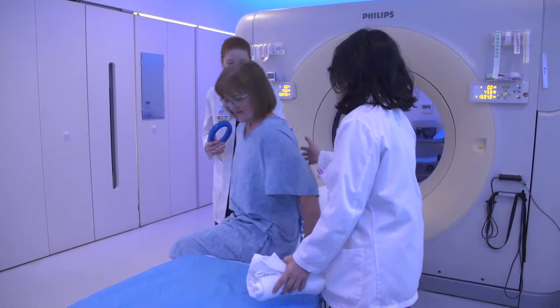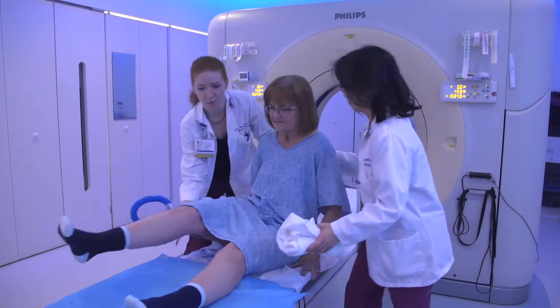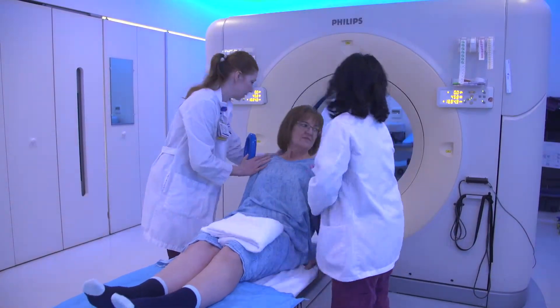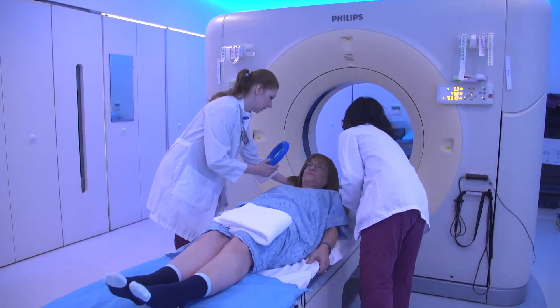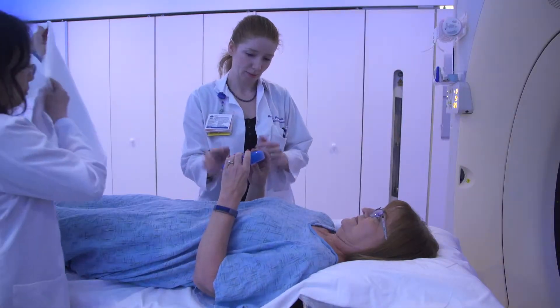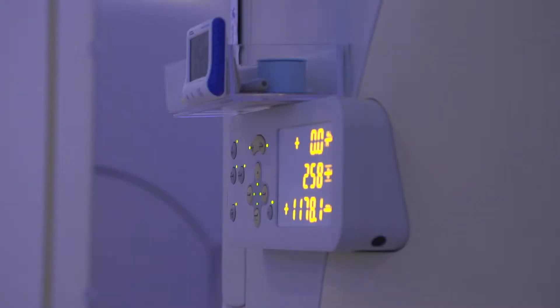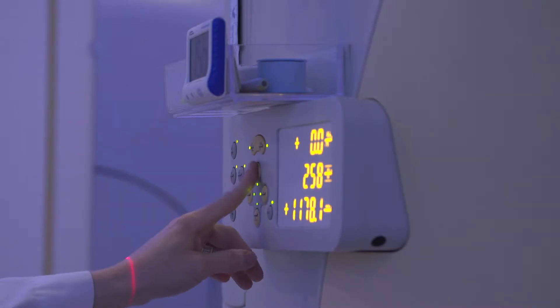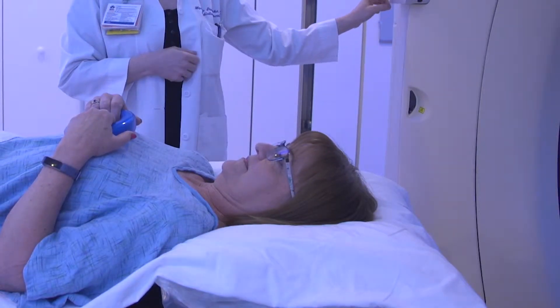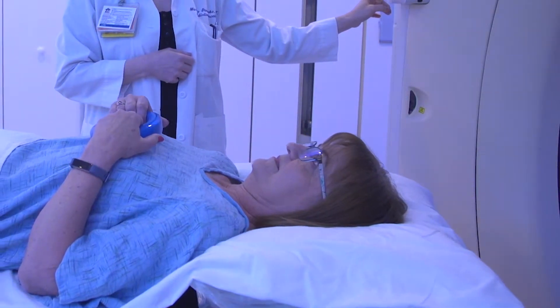Before the procedure begins, the therapist will describe what the doctor has ordered for your treatment. On average, the procedure takes from one to two hours. Your position, as determined by your doctor, will allow a targeted treatment to spare surrounding healthy tissues.